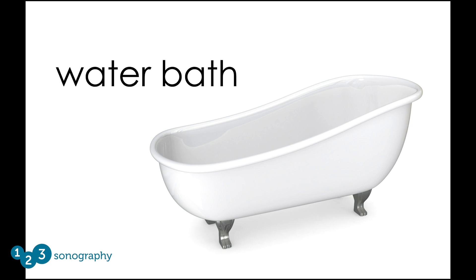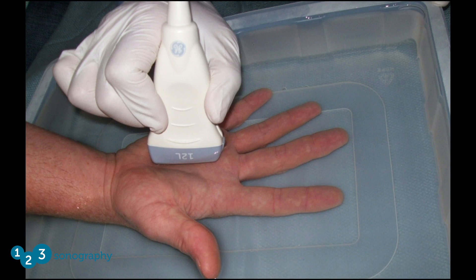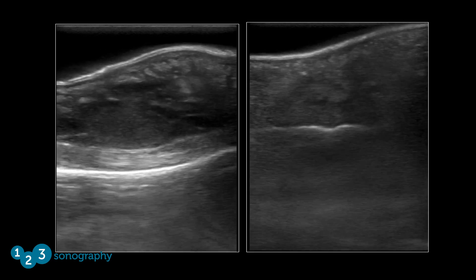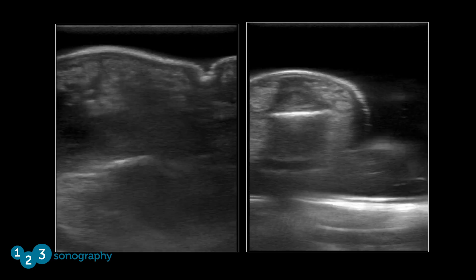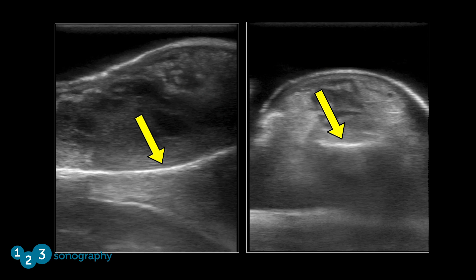Another strategy that is particularly useful for imaging the hands and the feet is a water bath. The hand or foot is submerged in water and the tip of the transducer is dipped into the water over the area of interest. The water acts as a perfect transmitter of ultrasound and provides great images. This is an image of the tip of a finger using a water bath. The anechoic area proximal to the soft tissue is the water, this is the skin surface, this is the soft tissue in the tip of the finger, and this is the distal phalanx.